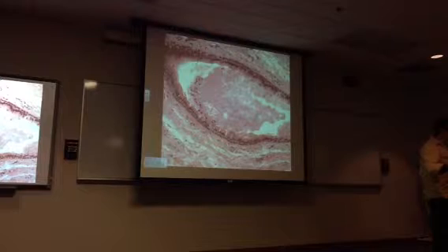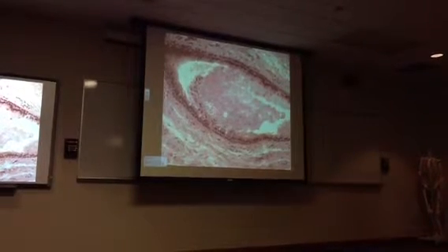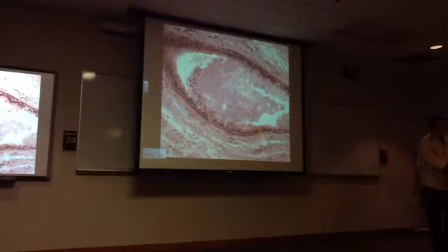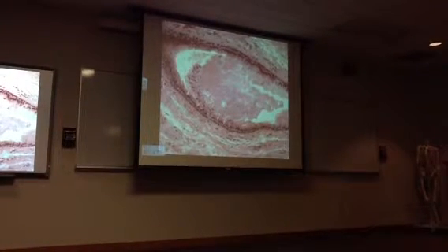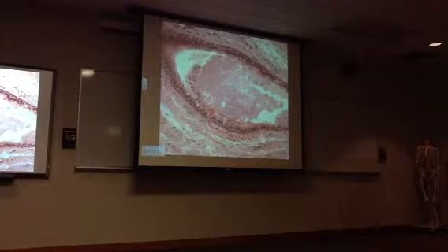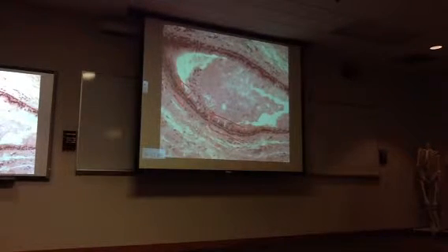This is a little bit trickier one. Identify this epithelium. Stratified. This is stratified columnar, okay? And I'm going to make that call based on cells that are in that area. Maybe on cells that are in that area.